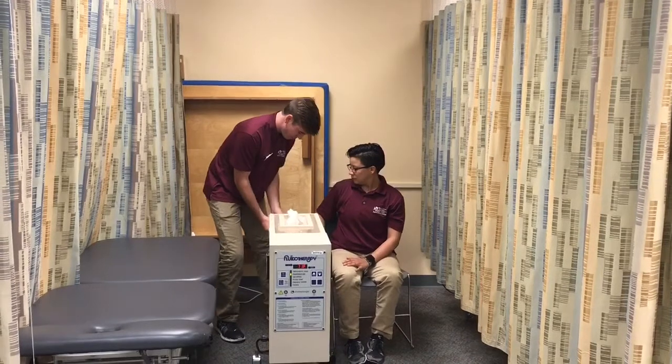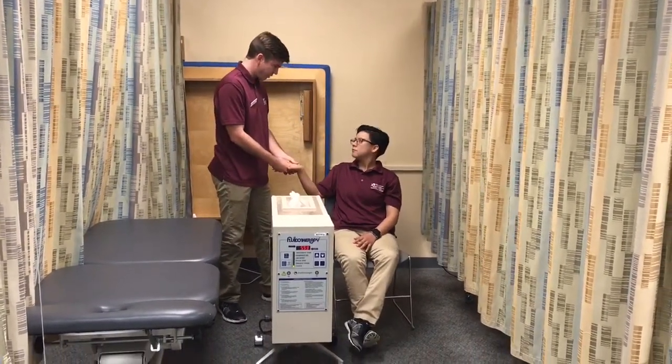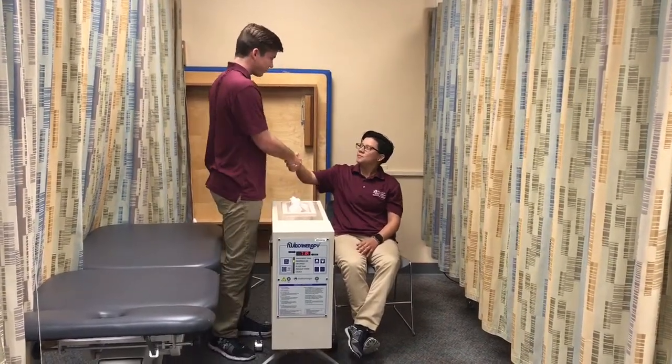Now I'm going to reassess your hand to make sure everything's fine — the sensation, can you feel everything? Things good? Alright, perfect. Your treatment is done. Thank you. And that was a demonstration of fluidotherapy to the hand.